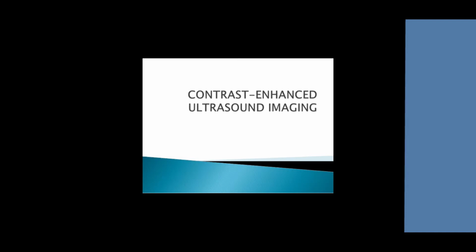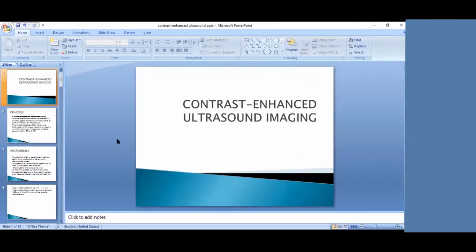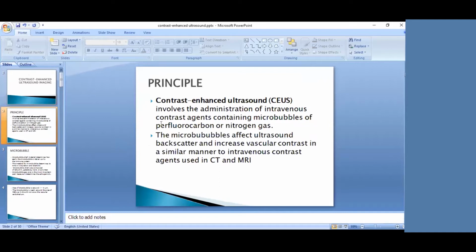Contrast enhanced ultrasound. Okay. So it is the same idea. We are using a contrast agent while performing ultrasound. So what is the principle of it?